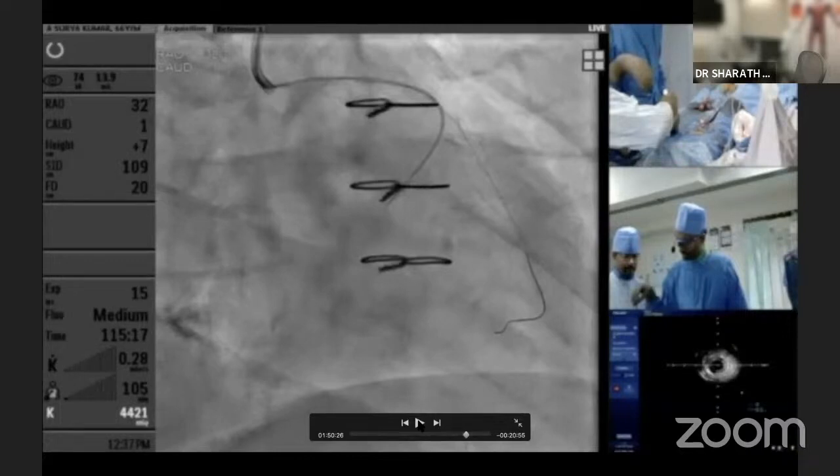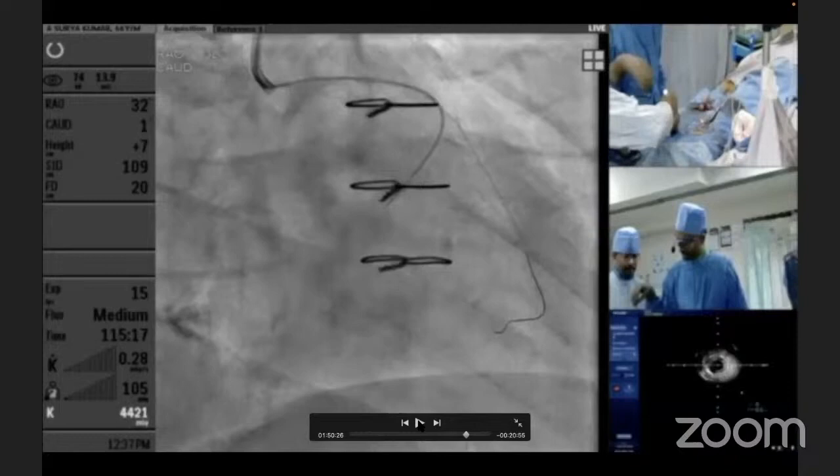But here the bad point was the proximal vessel? Yes, heavily calcified, and that is the CABG vessel, right? It is. Yes, we did IVUS, Vijay. But the point here is investment. Investment for the next procedure is the key. It's not just a subintimal dilatation of the CTO. I would see this investment as a comprehensive entity, not as a single entity.